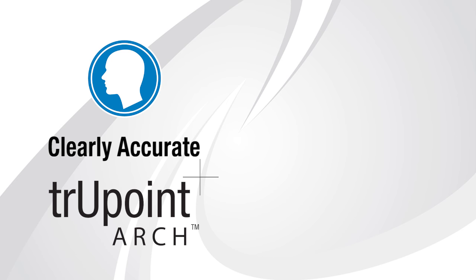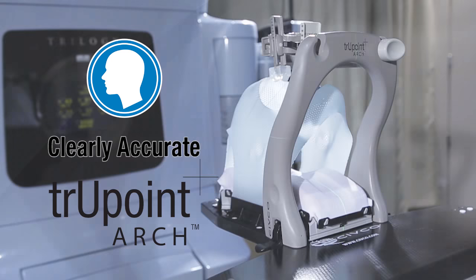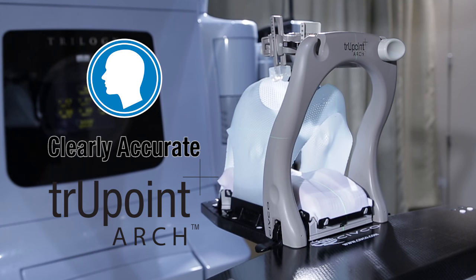The Truepoint Arch provides accurate setups for SRS-SRT treatments and is 510 cleared by the FDA for MRI use. This video is a step-by-step guide to setting up the Truepoint Arch.